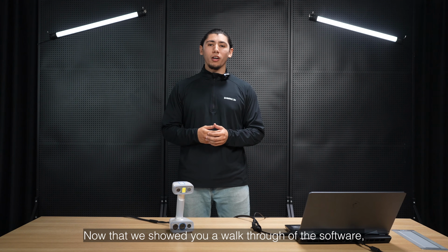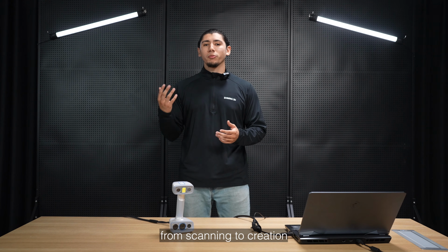Now that we showed you a walkthrough of the software, we'll now show you the complete workflow from scanning to creation.